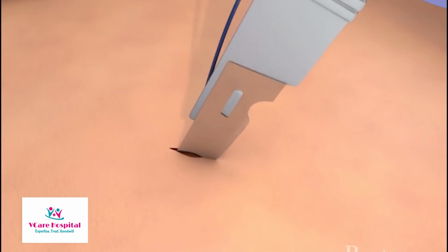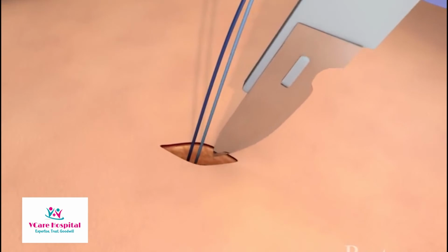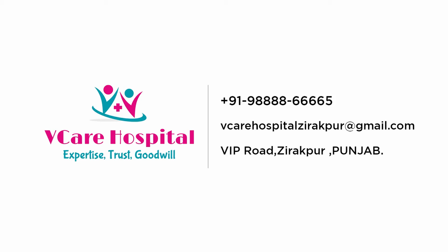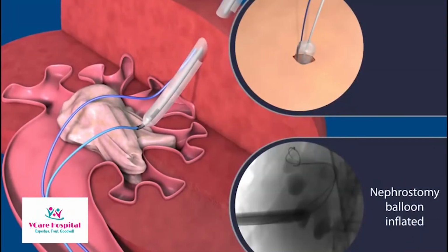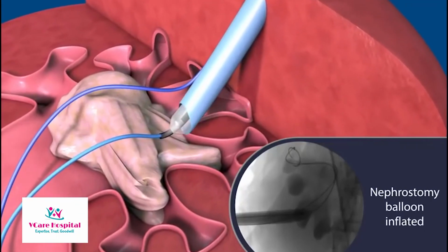Incise the skin in the back through the connective tissue in order to widen the existing puncture. Slide the balloon catheter over the stiff wire up to the stone. Inflate the balloon to the appropriate pressure. Slowly insert the renal sheath, twisting clockwise and counterclockwise until reaching the stone.